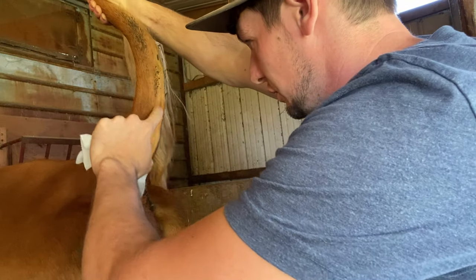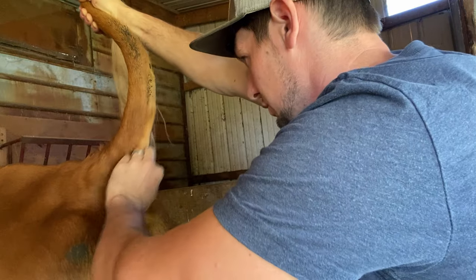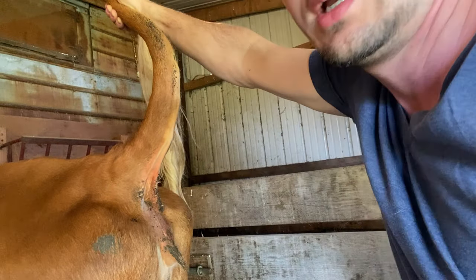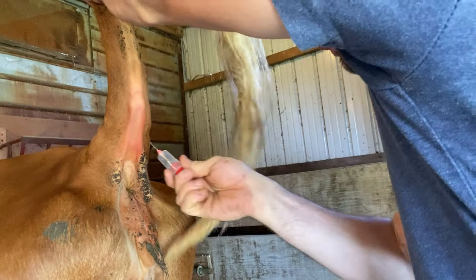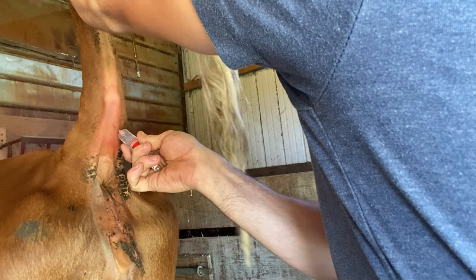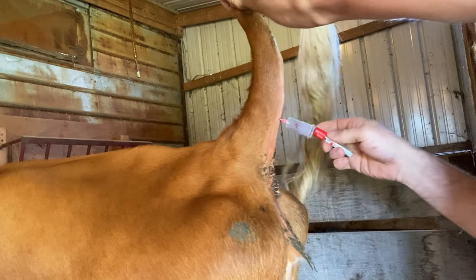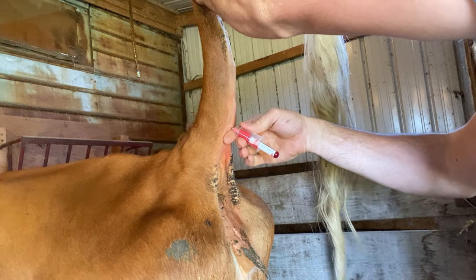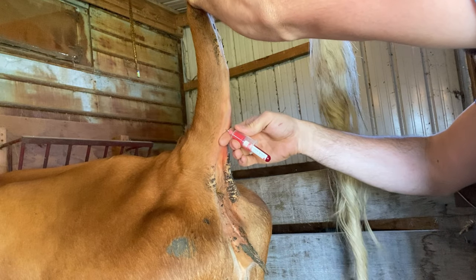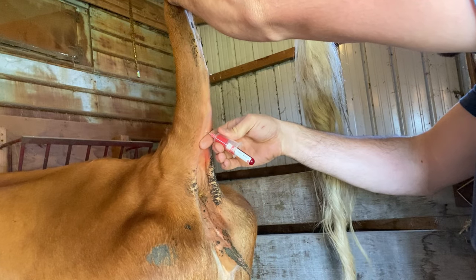There are some people that say to go between the two bones sticking out here, and some that say to go in here. I don't think it matters much as long as we go to the center and you go at an exact 90-degree angle to get in there. You do not want to puncture that before we get in there. All right, let's go right here. There comes the blood. There we go. I'm going to make sure I get plenty in there. She's still happily munching away on that feed that I gave to her.